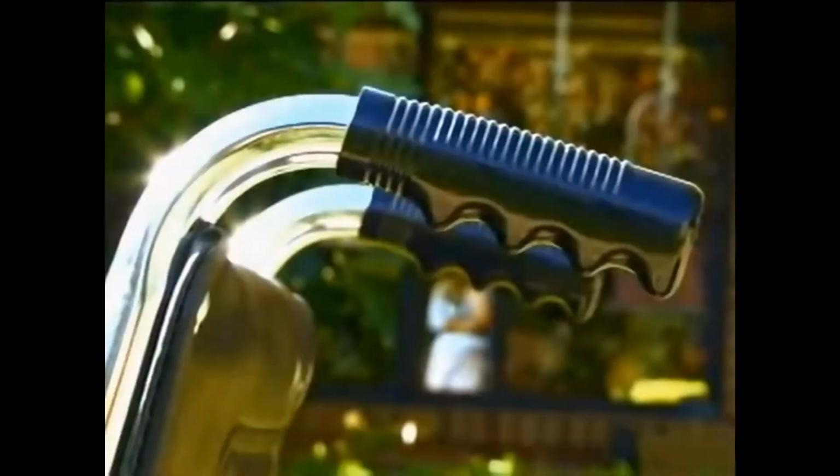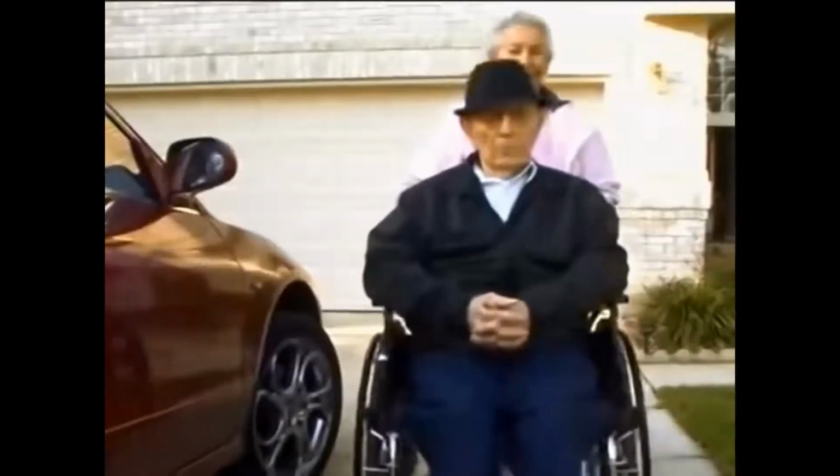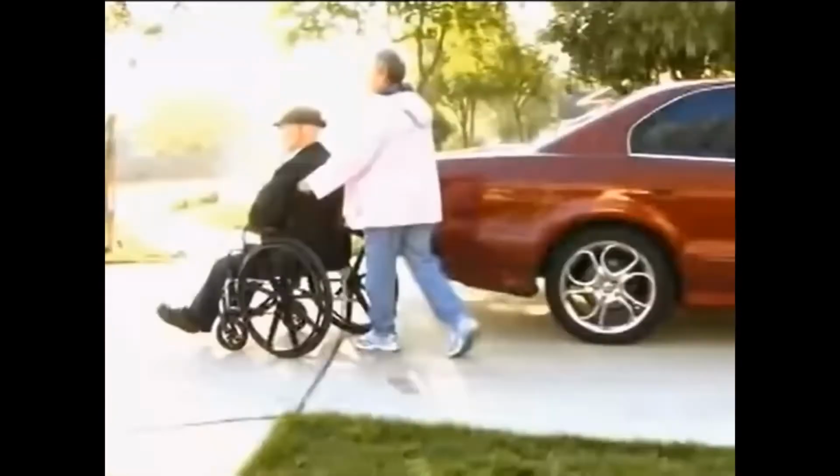There are many different types of wheelchairs available with many different features. Some chairs have footrests that flip up. Some have leg rests that can swing out of the way. Getting the wheelchair ready and in the right position will make the process go smoother. Wheel your family member from the house to the location of the car.